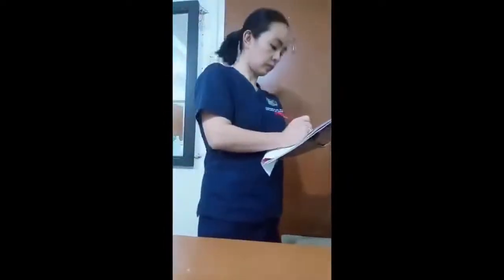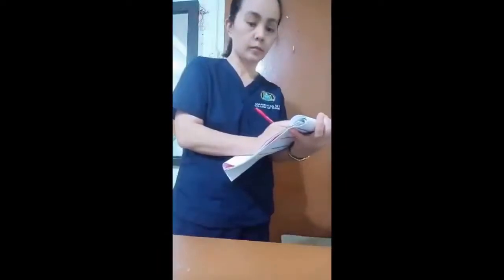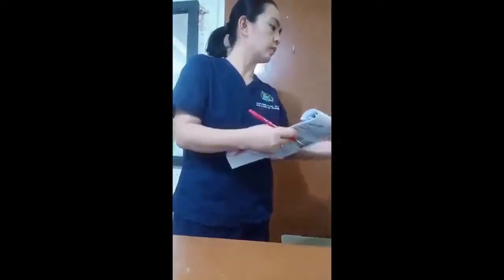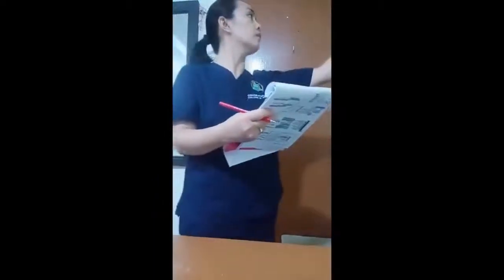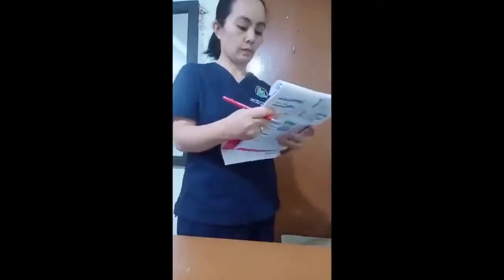Finally, document all relevant information like the IV bottle number, the type of solution and flow rate, time of IVF administered, medication given, and then the client's response.